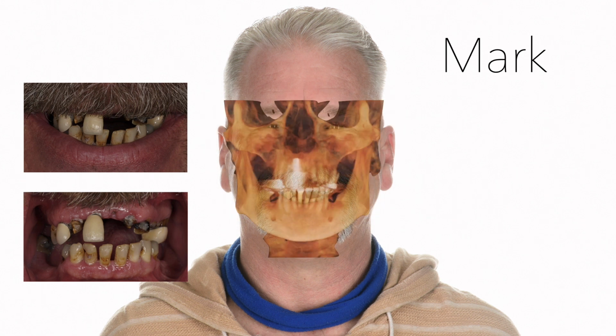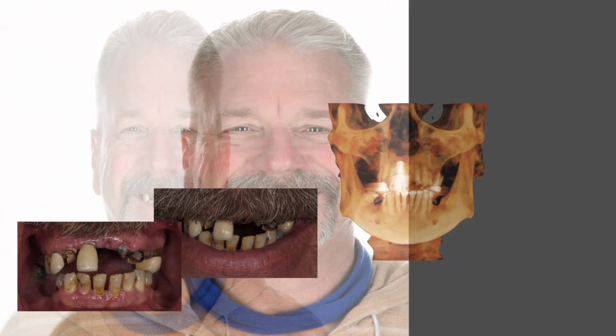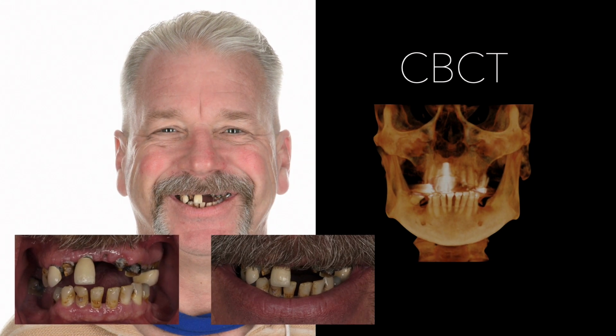Maybe what we would do initially is start to look at his bone structure. So we get a CBCT, and we evaluate it. I'm going to say a certain phrase to you over and over this weekend, and it's going to go exactly like this, because it's the exact same phrase I say to the patient when I sit them down in my consultation room, give them a cup of coffee, and pull these exact same images up on the TV in front of them.